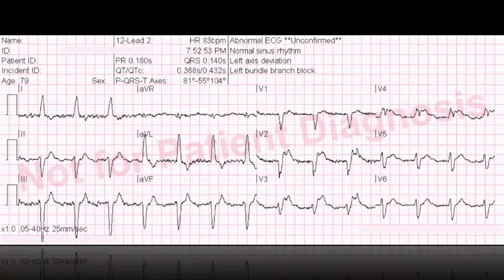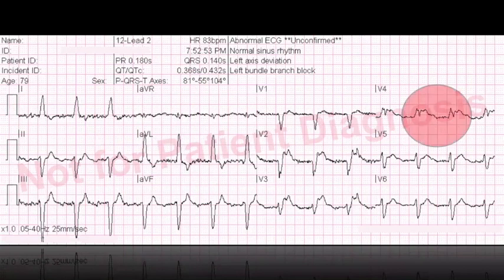Let's look at another example. Do you see criteria A or criteria B? I see criteria A in lead V4. The QRS is going one way and the ST segment and T wave are also going in the same direction. That shouldn't happen in a left bundle branch block. That alone — in just that one lead — is enough to say that's positive for Sgarbossa's criteria and diagnostic of STEMI in the presence of a left bundle branch block.